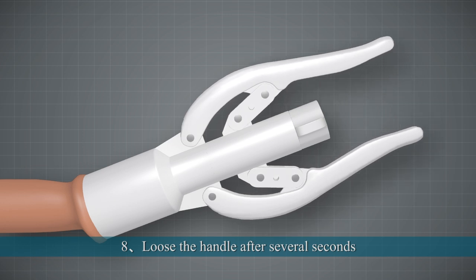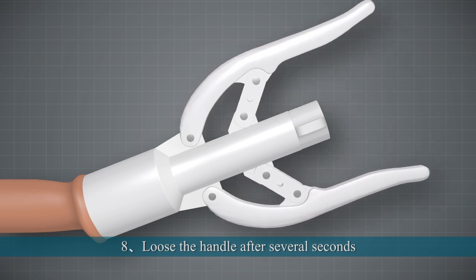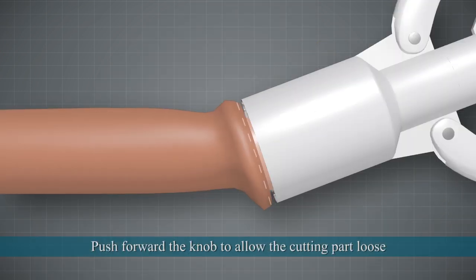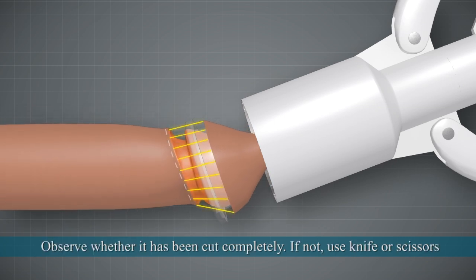8. Loosen the handle after several seconds. Left hand holds the device while the right hand loosens the adjustment knob 5–10mm. Push forward the knob to allow the cutting part loose. 9. Observe whether the foreskin has been cut completely; if not, use a knife or scissors.